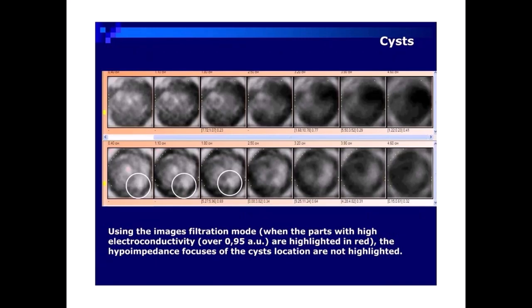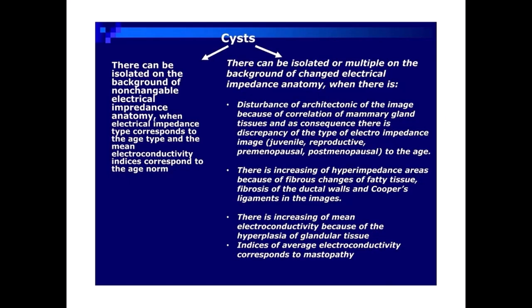Using the image filtration mode, when parts with high electroconductivity over 0.95 AU are highlighted in red, the hypo-impedance focuses of the cysts' location are not highlighted. Cysts can be isolated on the background of non-changeable electrical impedance anatomy, when the electrical impedance type corresponds to the age type and the mean electroconductivity indices correspond to the age norm. They can also be isolated or multiple on the background of changed electrical impedance anatomy, when there is disturbance of architectonics of the image due to correlation of mammary gland tissues, and as a consequence there is discrepancy of the electro-impedance image type — juvenile, reproductive.